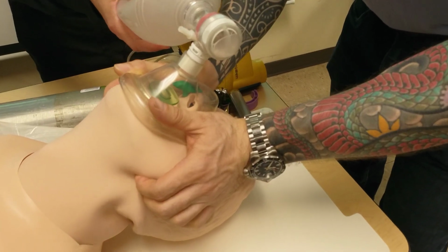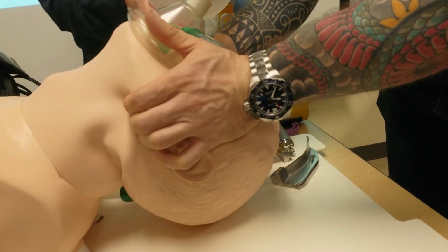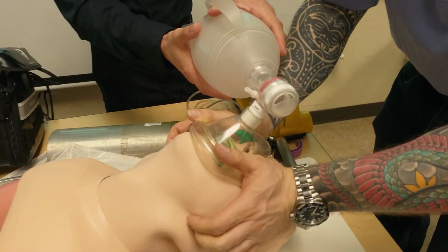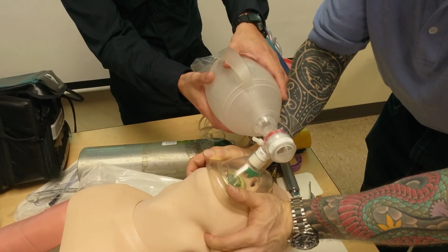Squeeze. 2 one-thousand, 3 one-thousand, 4 one-thousand, 5 one-thousand, 6. Again, 2 one-thousand, 3, 4, 5, 6.